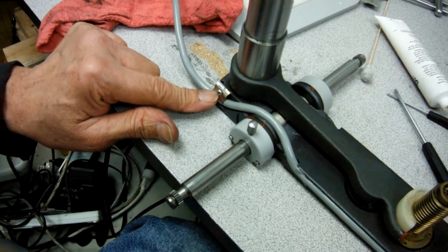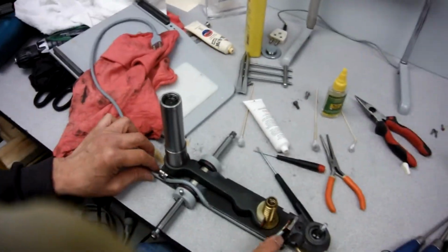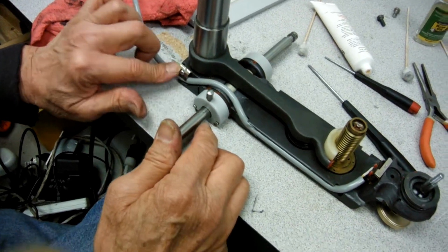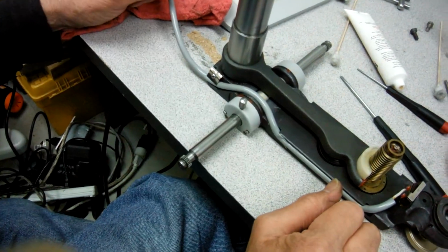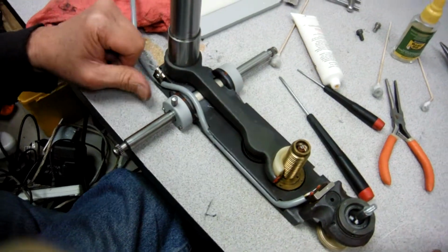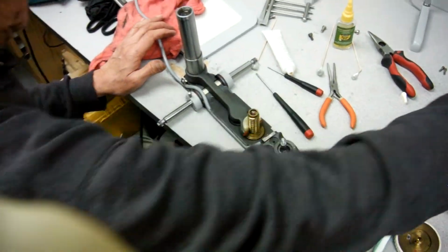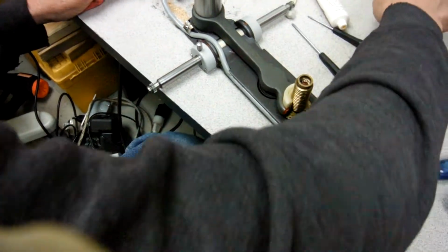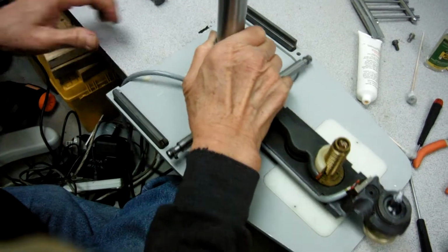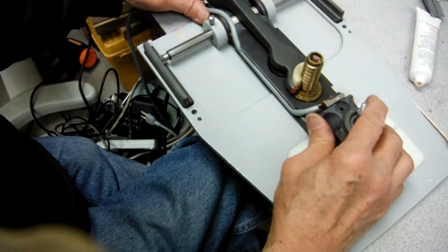So if it doesn't work, you might check the continuity of this end and that end to see which one is bad, or you can check it right here, and see if the light comes on and off and things like that. Then you can cut this part and resolder the wire inside there, put it back, and use it. Okay, assuming everything is working well, then we can put the cover back. Oh, by the way, before you put everything back, you can also check and see if your slit lamp movement front and back is good. And then you can put it back in there and feel it.